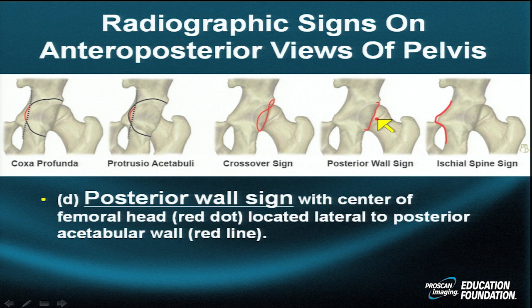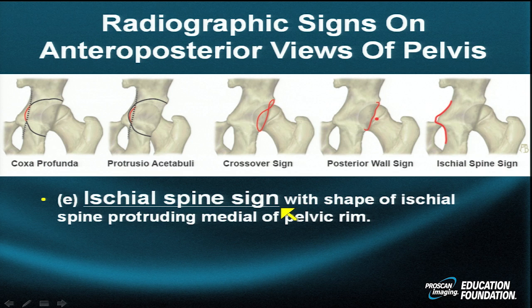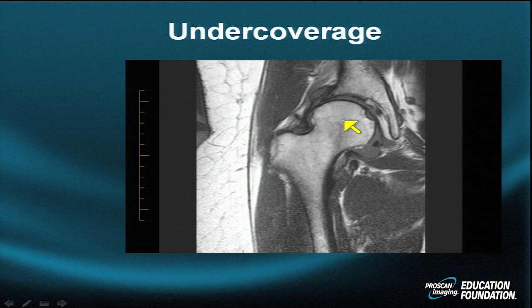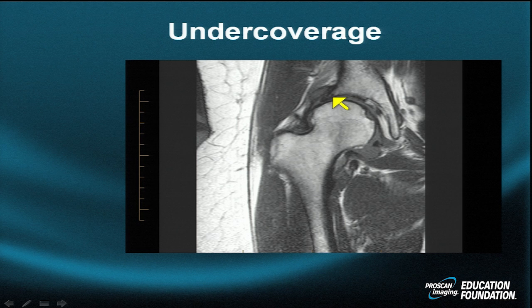In the posterior wall sign, the center of the femoral head (small red dot) is located lateral to the posterior acetabular wall (red line). For the ischial spine sign, the ischial spine protrudes medially to the pelvic rim. As an example of under-coverage: if we draw a vertical line and another along the edge of the bony acetabulum, that center edge angle would be well under 20 degrees — indicating insufficient coverage.